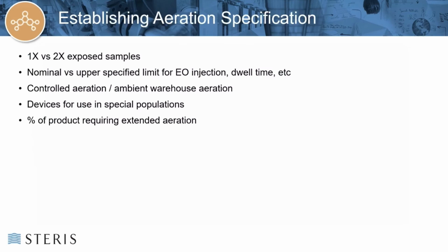The graph shown here uses data created for this discussion. Looking at the graph, the gray line meets the allowable limit within 24 hours of aeration. The blue line meets the limit within 48 hours of aeration, but the orange line does not reach the necessary aeration. A dissipation curve could be established to predict the applicable aeration time for the orange line to achieve the allowable residue.